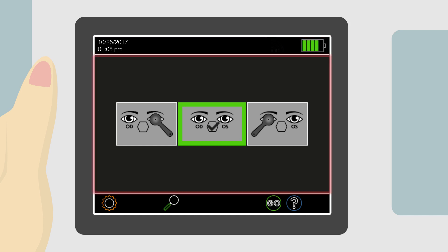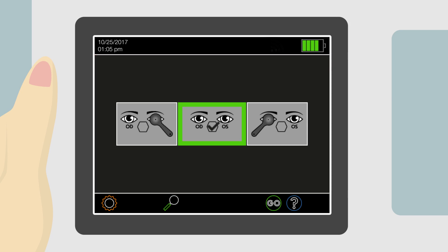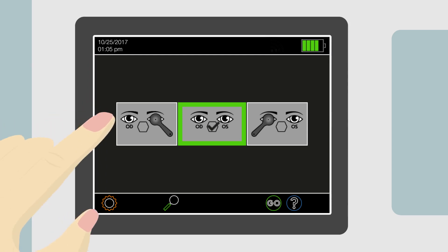The information section is where the main body of content is located. Shown here on the home page, the information section contains measurement mode selections. A measurement can either be taken binocular or monocular.